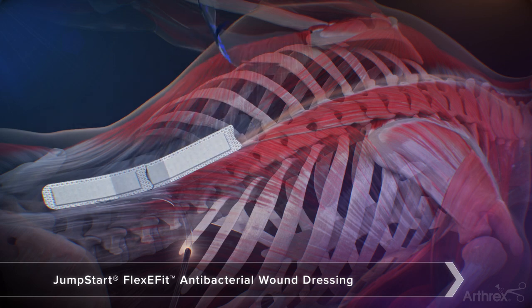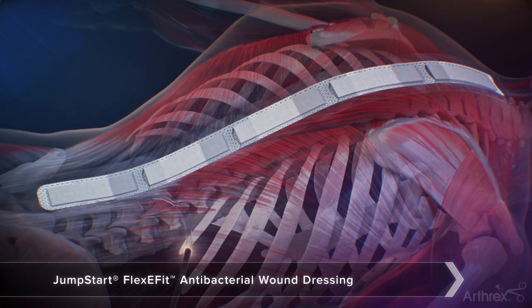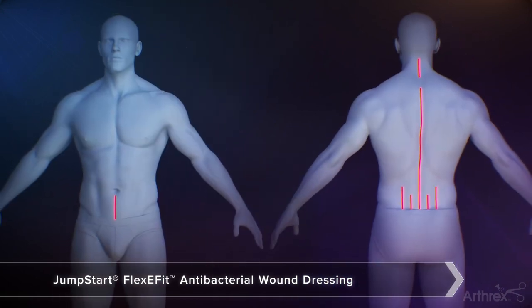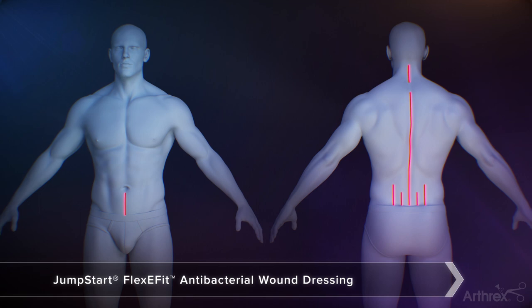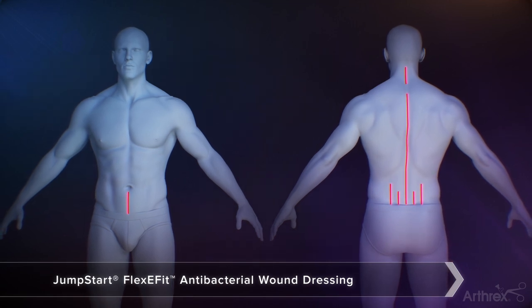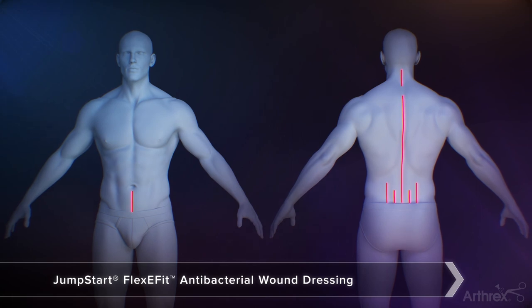Jumpstart is ideal for dressing any type of surgical site wound, with size offerings that can cover an endoscopic approach portal all the way up to a T2 pelvis incision. Examples of surgical approach incisions where Jumpstart can be used as a wound dressing are ACDF, PCF, PLIF, TLIF, OLIF, ALIF, and deformity correction.